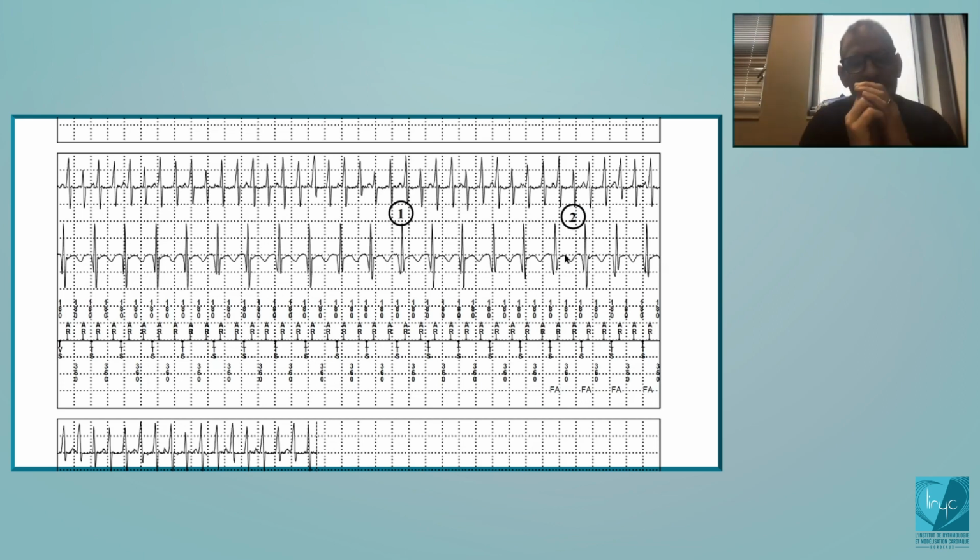The second thing that you need to know is that in the Medtronic devices, everything in the discrimination is based on the comparison between atrial rate and ventricular rate. Therefore, in Medtronic devices, they work with very short atrial blanking post-ventricular sensing. To give the capacity of real analysis of the atrial rate, you need to work with short blanking.